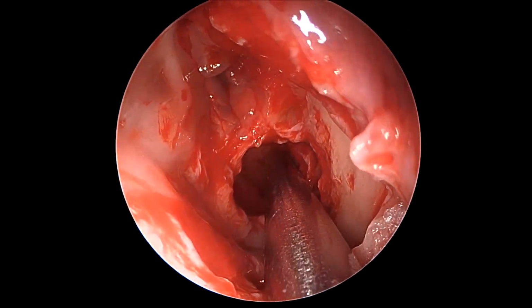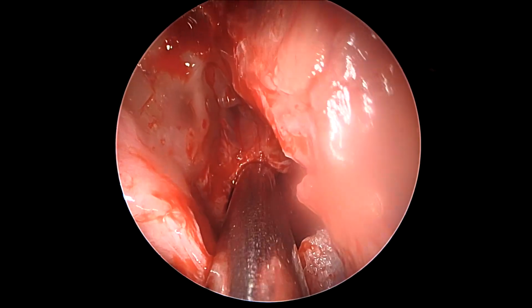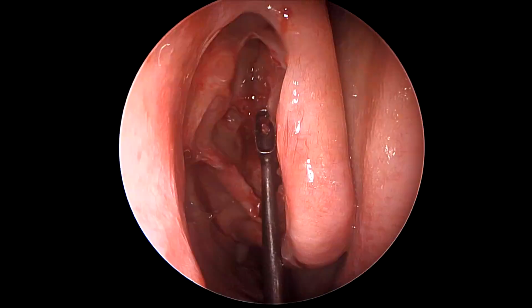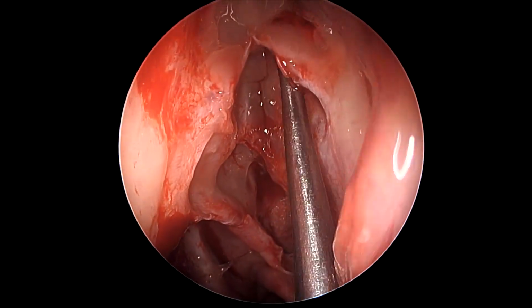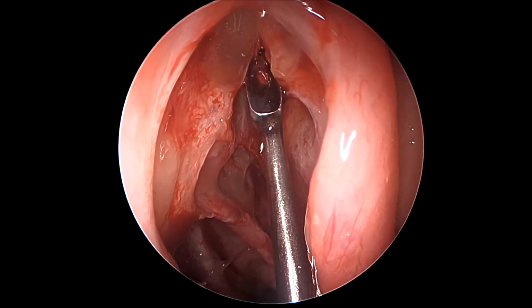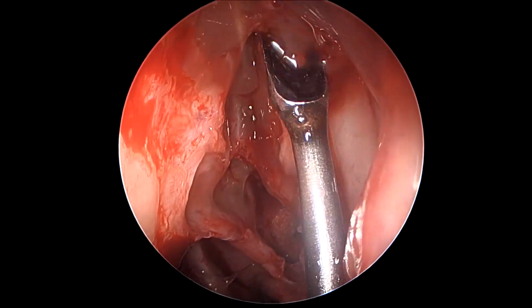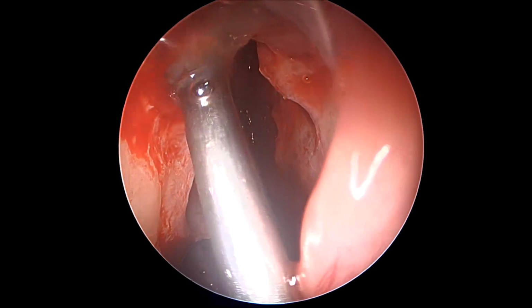Once the sphenoid sinus ostium has been sufficiently widened for good access intraoperatively as well as for postoperative irrigation, one can see even the lateral recess exposed. We resort to again using a frontal sinus curette to clear the party wall from the anterior ethmoids and to open the area of the frontal recess and sinus, which again was a prime concern in this patient.